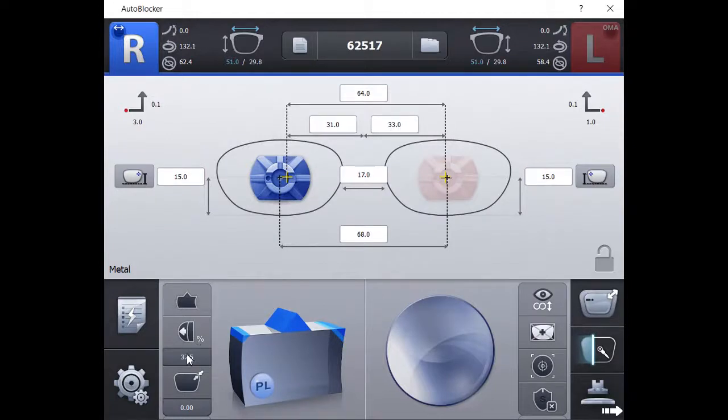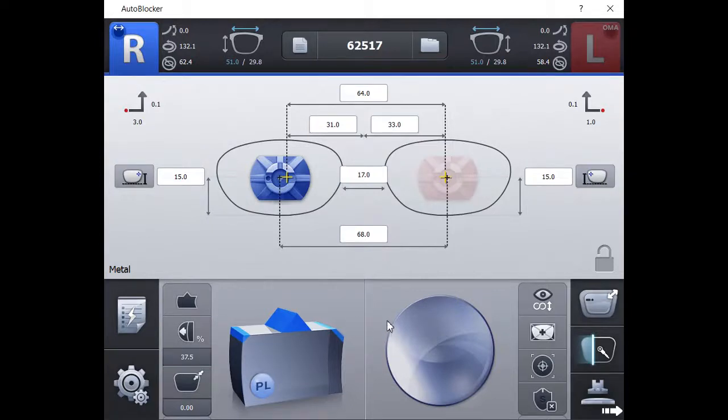Next, you should verify all information pertaining to the edging process. This includes bevel placement, lens material, and safety bevel.